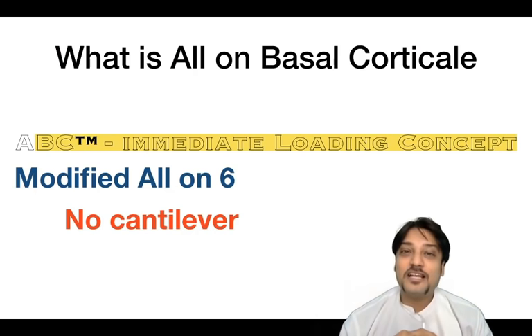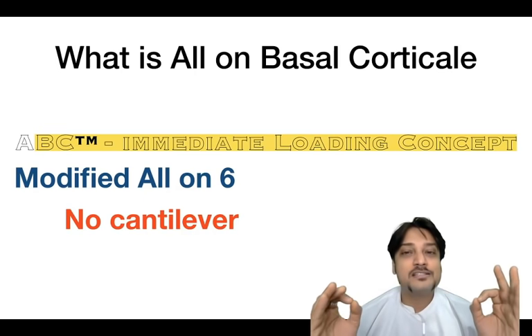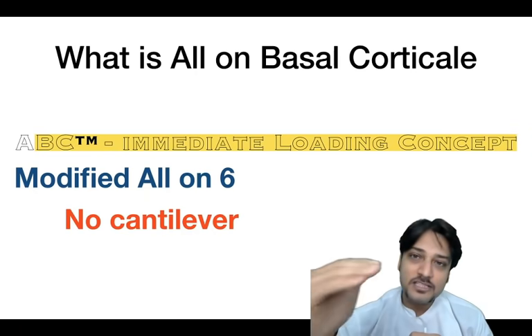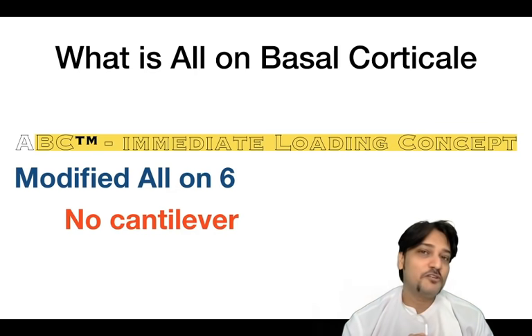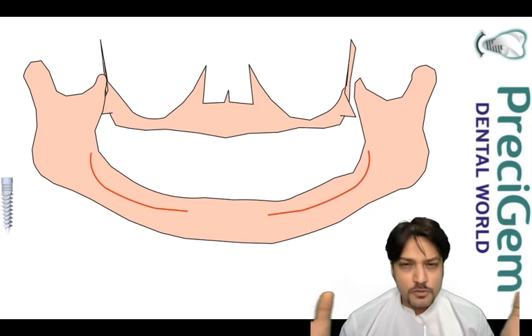Now I will tell you about what is all on basal cortical. It is nothing but a modified all on 6 concept where there is absolutely no cantilever, zero cantilever, and it's an immediate loading concept. Of course, that means patients receive teeth in just 3 to 5 days. It's a modified version of an all on 4 or all on 6 or all on 8. So as you very well know, this is upper and lower jaw moderately resorbed bone case.